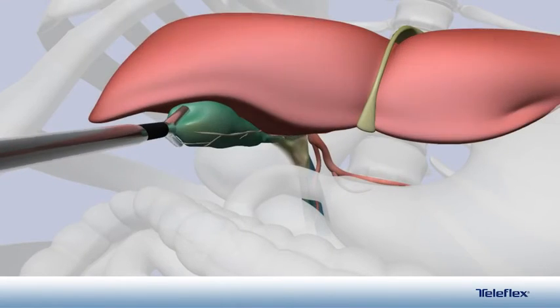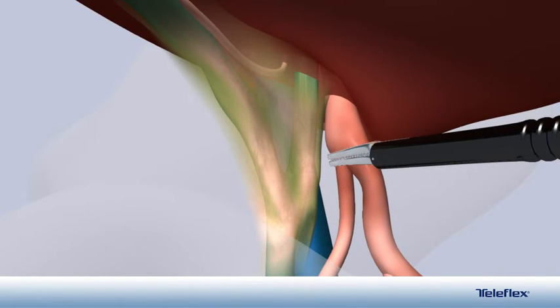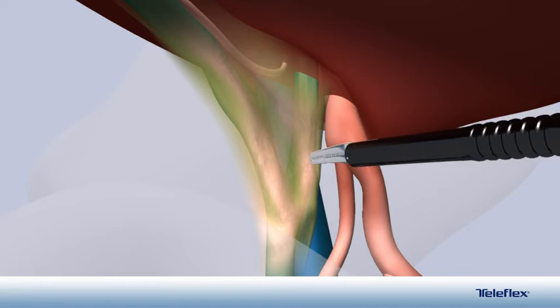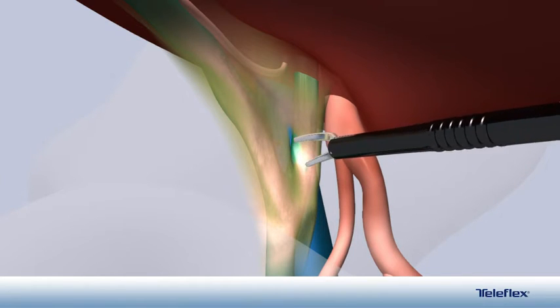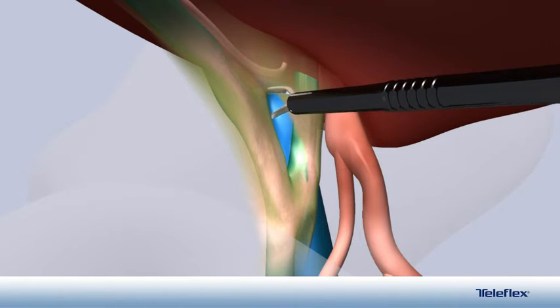Using pilling laparoscopic instruments, the triangle of Callot is exposed. Blunt dissection is used and the cystic duct and cystic artery are identified. The cystic duct is skeletonized using a Maryland dissector.